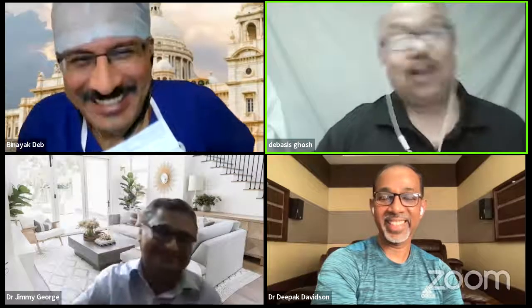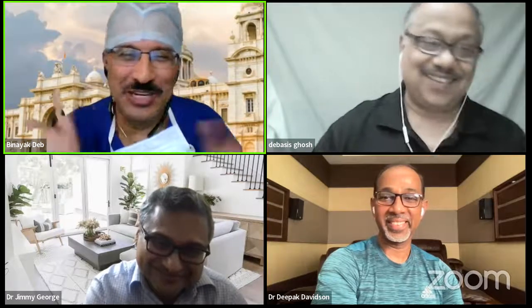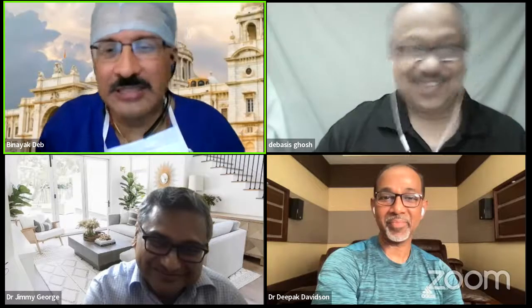On the other hand, if you go to a simpler provisional strategy or the culotte, it's significantly easier. So you must understand the capability of your setup. That is very, very important. And also the philosophy of life: Europeans stop their work on Fridays, and also their arteries are much bigger. Much bigger, yes, absolutely. And we are in the middle. I think we are very well placed in India. We have very good operators of crush, excellent operators who also do culottes very well. So that's very well done.